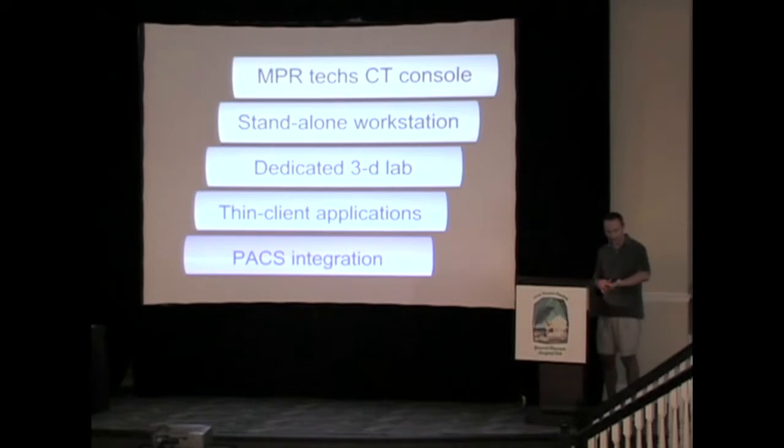Just wanted to get an idea from the audience, how many of you have sagittal and coronals provided routinely for all of your cases? That's terrific, and I'd say that's at least half of the room. That's fantastic. Standalone workstations are usually necessary for doing 3D imaging, and a number of departments will have dedicated 3D imaging labs. How many of you know if your radiology department has a dedicated 3D imaging lab where they do 3D work for you? So it's still a significant, maybe 1 in every 4.